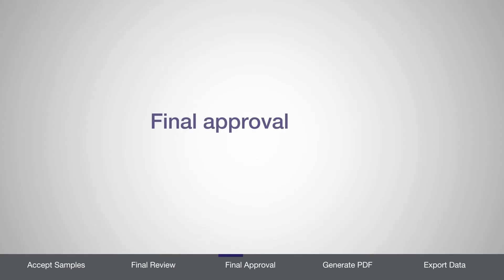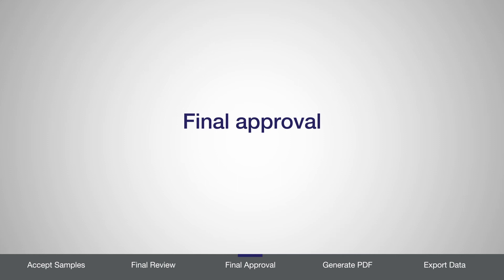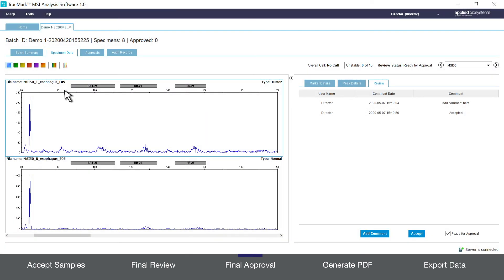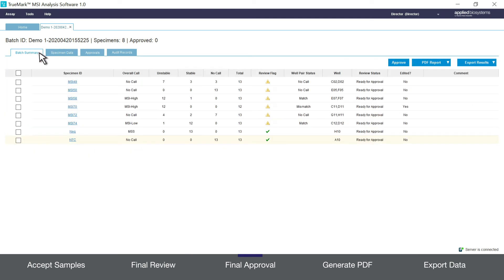Once all samples have been made ready for approval, a user with the appropriate permission can perform the final approval. To do so click on the batch summary tab and confirm all the samples in your batch say ready for approval in the review status column.